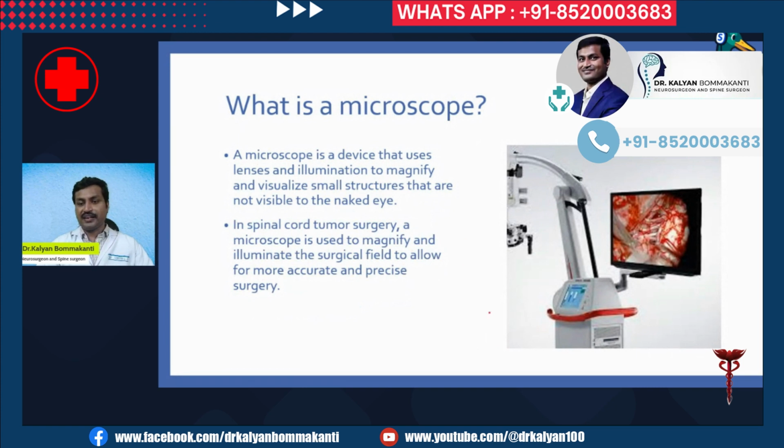So this is a surgical microscope. What is a microscope? Everyone knows what a microscope is, so let me be concise. A microscope is a device that uses lenses and illumination to magnify and visualize small structures that are not visible to the naked eye. In spinal cord tumor surgery, a microscope is used to magnify and illuminate the surgical field to allow for more accurate and precise surgery.